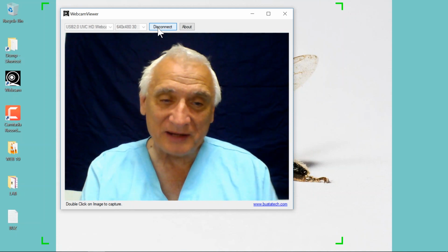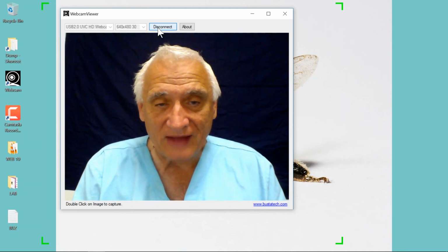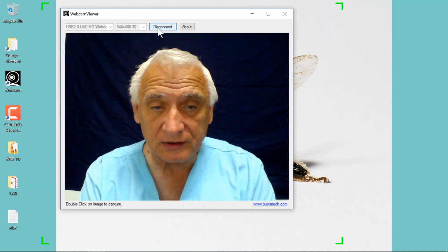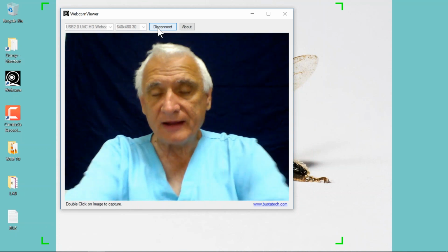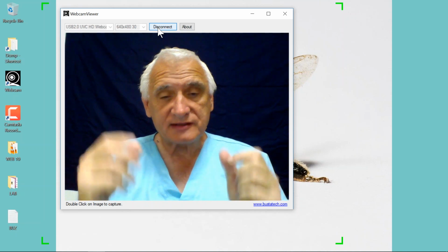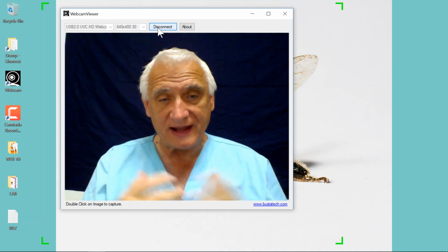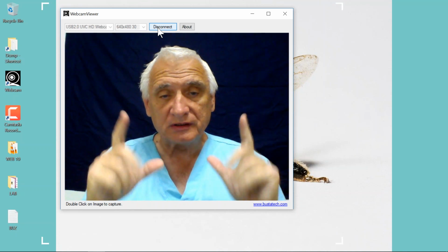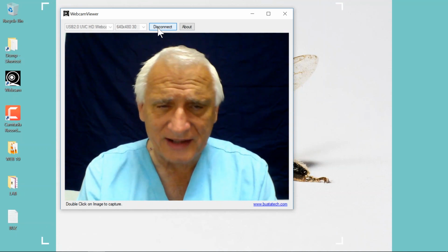Now, you could get up off your chair in the auditorium and go down to the smelly formalin pathology lab and open up your microscope drawer and hope nobody stole or broke your scope, or hope your lights didn't burn out, and hope your eyepieces are in focus, and hope somebody will be able to sit on the other side of your microscope and show you what you're looking at. Well, that used to be a real problem, but now it isn't, because everybody here will be looking through their microscope with me, and I'll be talking to them.